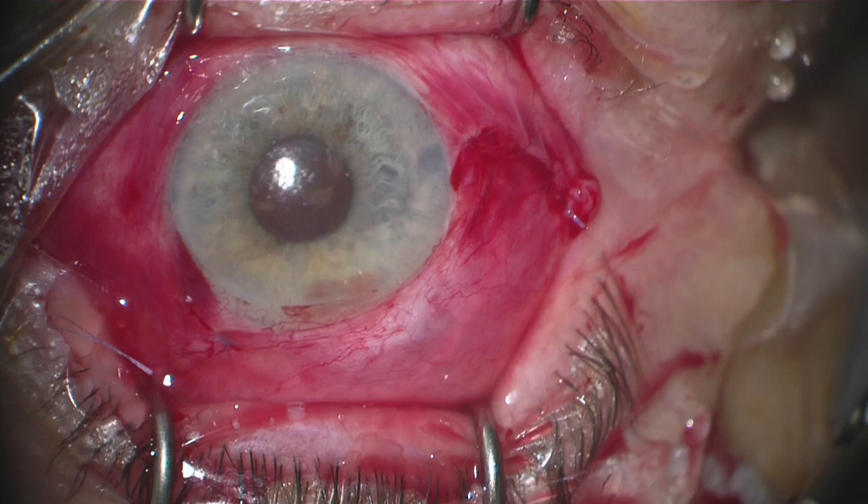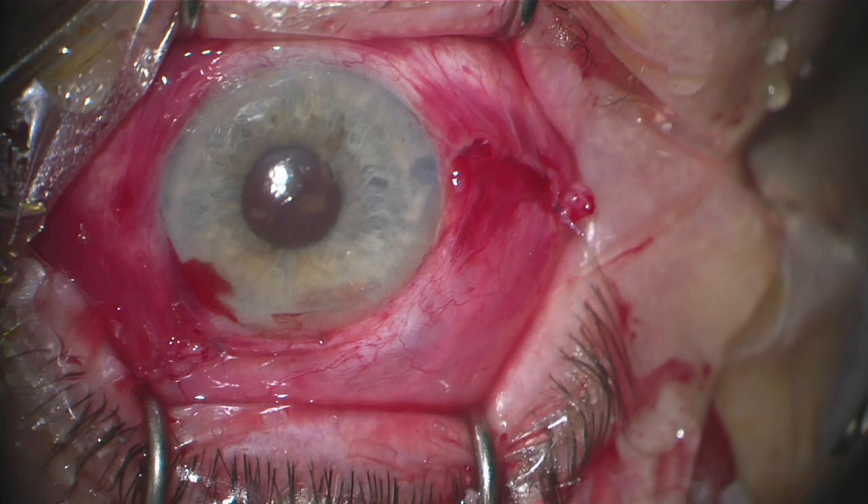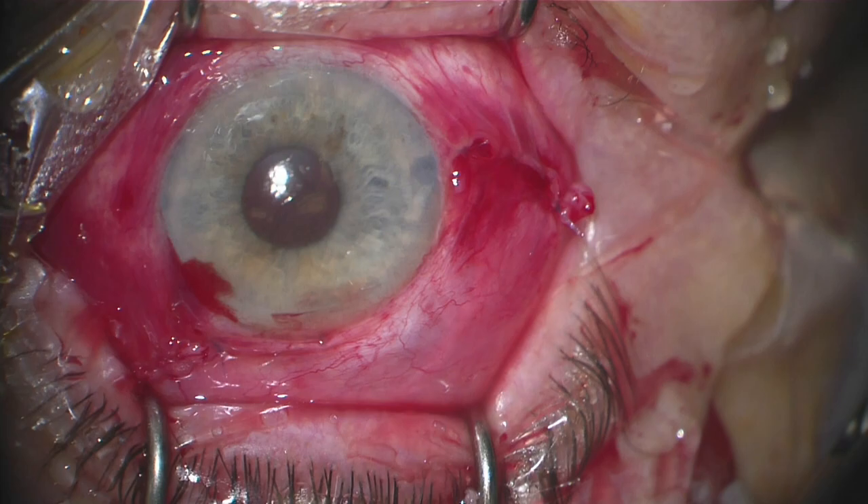Once we have a nice closure, we will inject an antibiotic and steroid mixture beneath the inferior conjunctiva and palpate the globe to make sure that the pressure is where we want it, which is in the low to mid-teens.